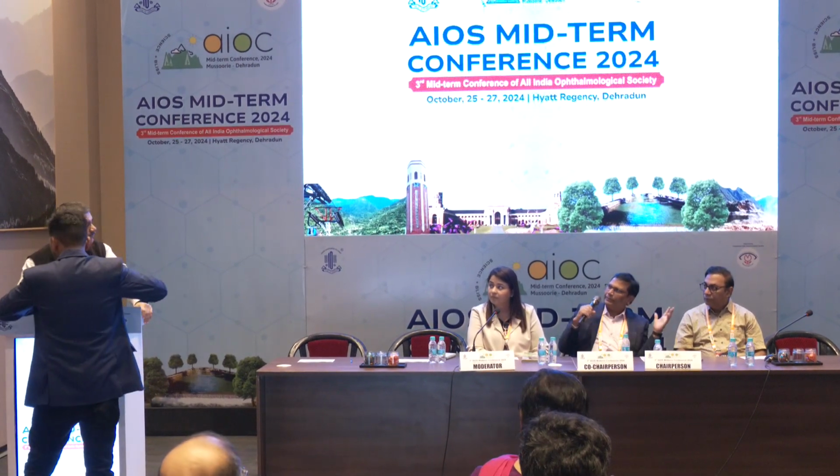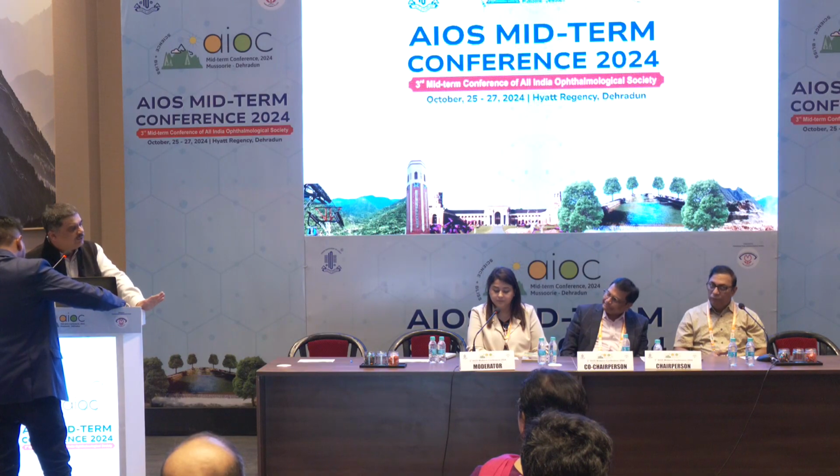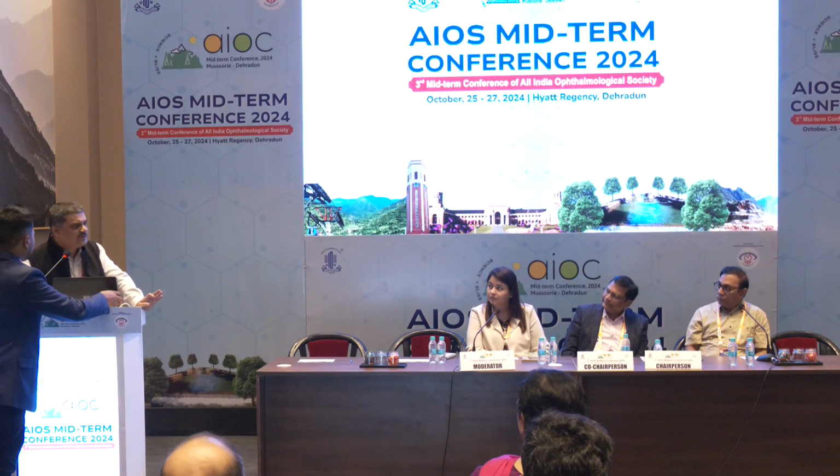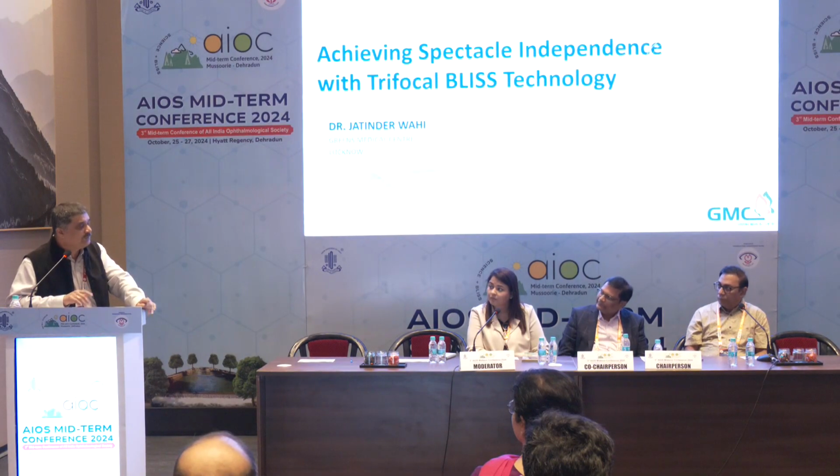Nice presentation. Just one question related to the surgical: how much dilatation do you need before putting the lens, full dilatation or semi-dilatation, what is your preference? Actually, now also I need a full dilatation. That is the first criterion for me, because your comfortability is a must. I should not be rubbing the iris that much. Full dilatation is very important.